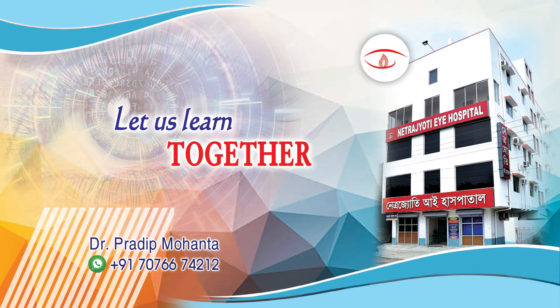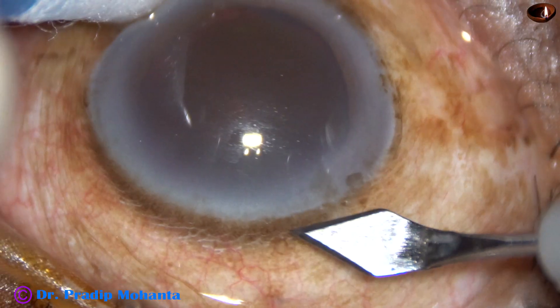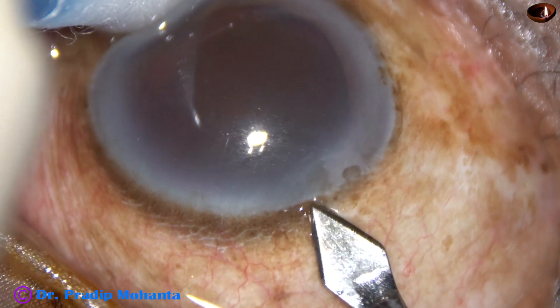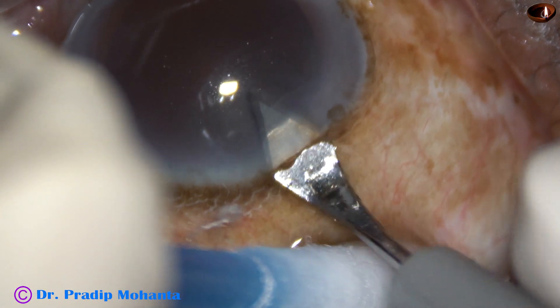Friends, welcome to my workplace at Rana Ghat, West Bengal, India. This is a very hard cataract. Nuclear sclerosis in this case is grade 5+. We can call it cataracta nigra. Let us observe this surgery.